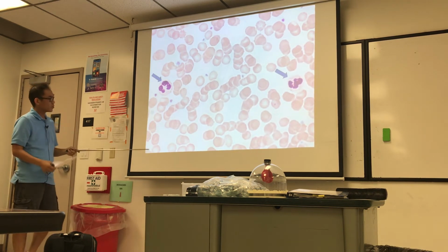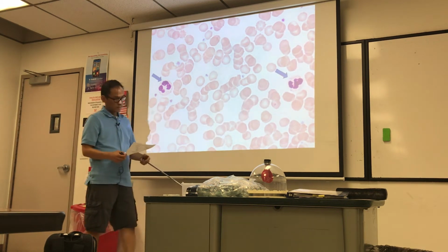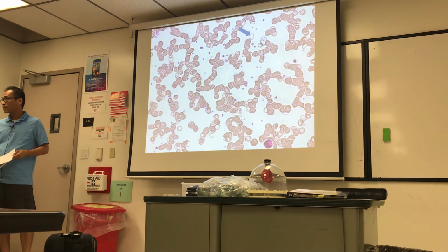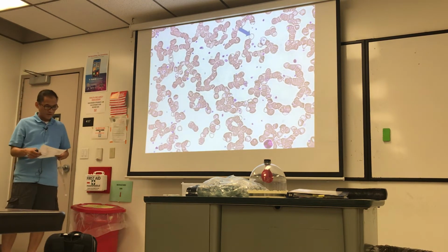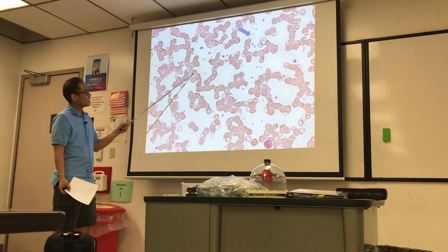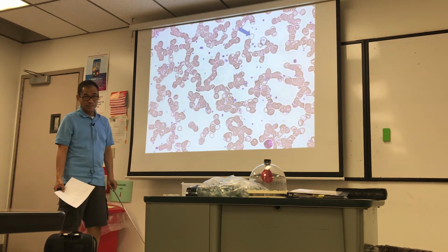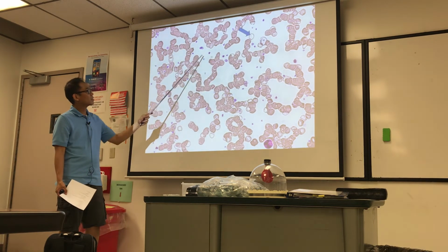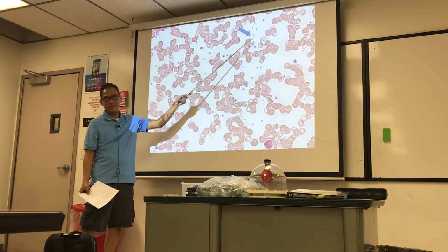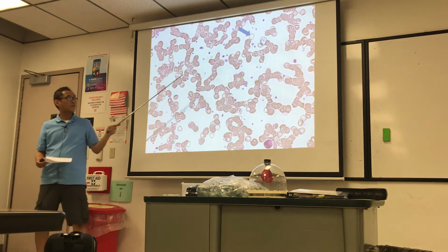All right, here's just a slide showing you good old neutrophils. Both arrows are pointing to neutrophils. This is iron deficient anemia. It's not going exactly in order. In iron deficient anemia, you get this kind of clumping of the RBCs because they're less dense, so they tend to clump together. A lot of platelets, but that's a microcyte. It has less hemoglobin in it, so it's more translucent to the microscope light. Microcyte is what the arrow is pointing to.